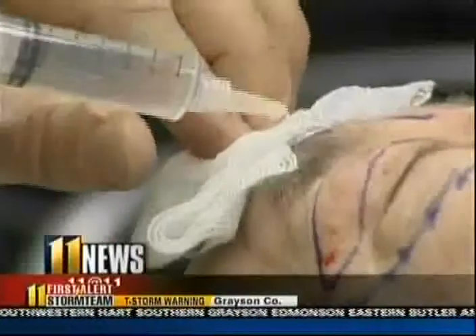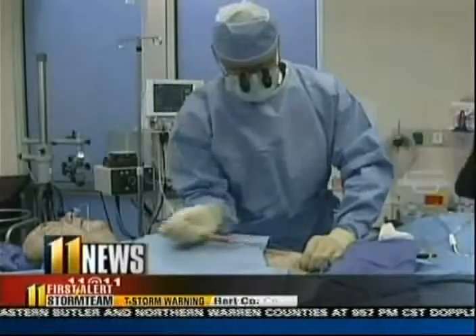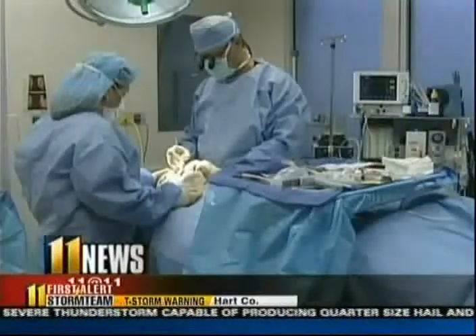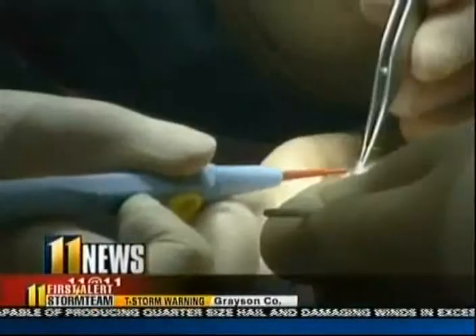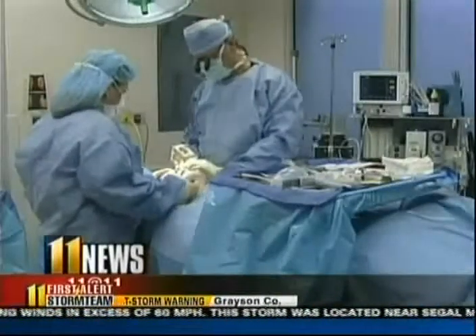Dr. Jerry O'Daniel injects the local anesthesia for numbing and to decrease bruising. He then begins retrieving fat cells from Reed's stomach. This is our building materials, fat cells and stem cells. Building blocks to help refluff and reshape the face. We're going to trim the skin, sculpt the muscle and fat.